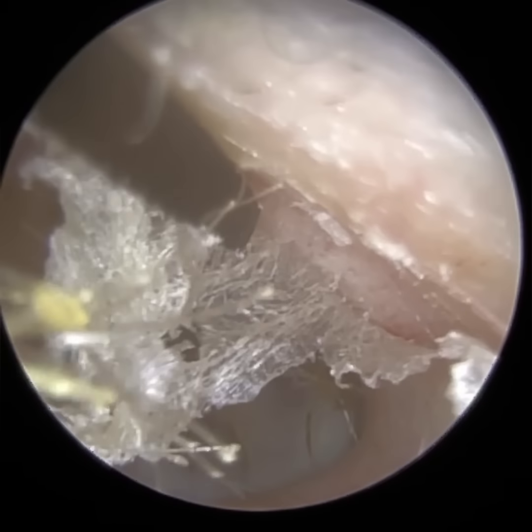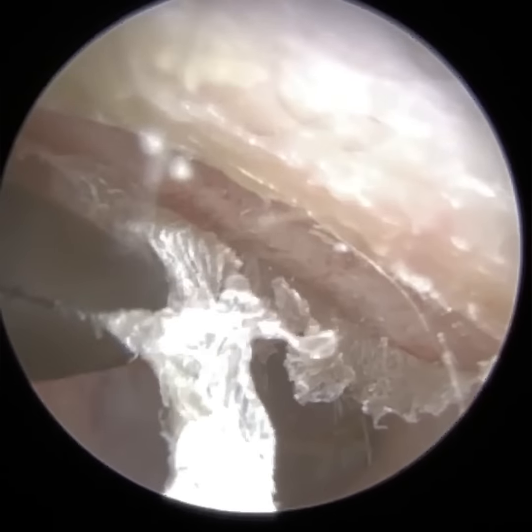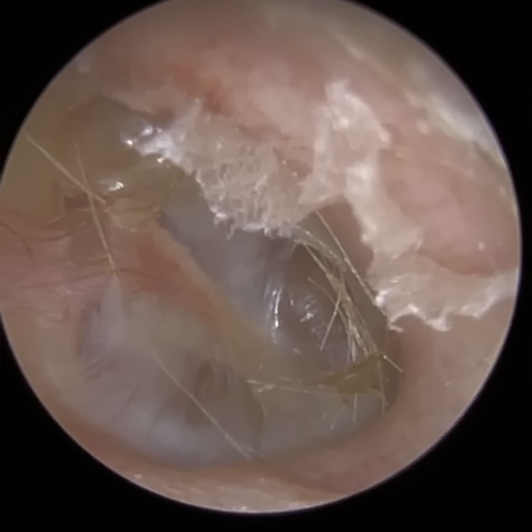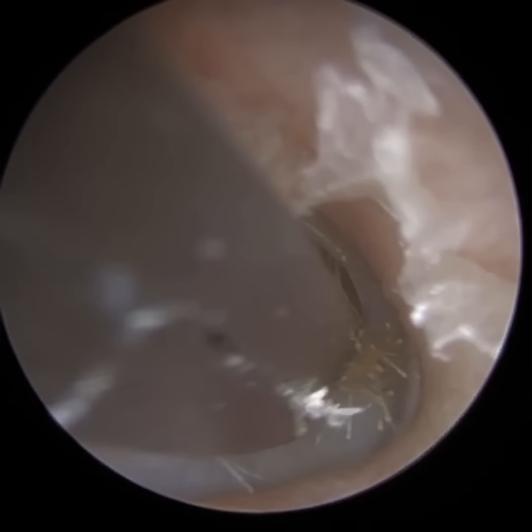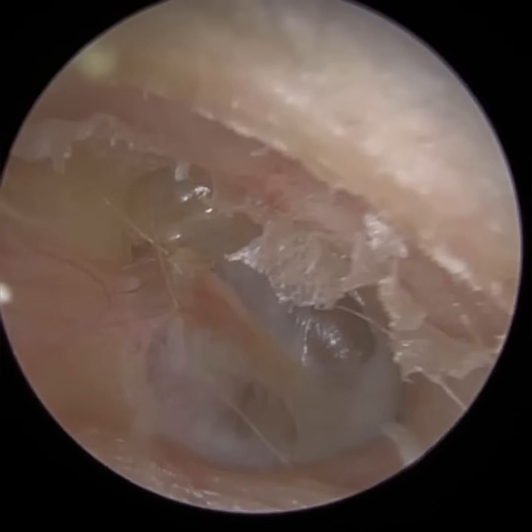So basically they activate osteoclasts, which are specialized bone cells that sit on the surface of the bone, and what these osteoclasts do is break down bone tissue into its minerals, and they redistribute these minerals through the bloodstream to other parts of the body where new bone is being formed. So that bone that's missing there is probably being used elsewhere in the body. It's broken down, of course, but it's then recycled. And so that's normally common with a retraction of the eardrum.